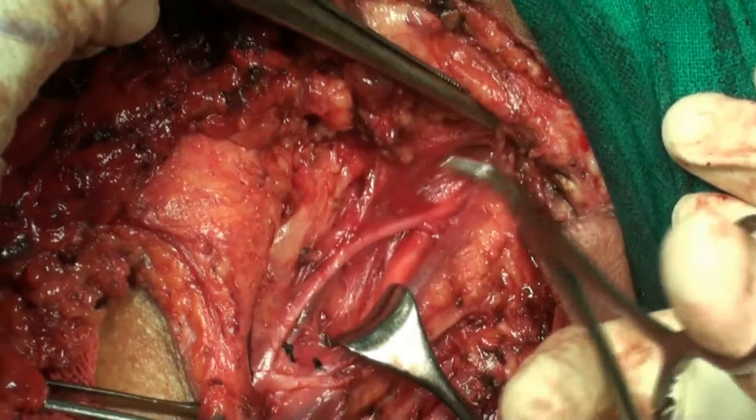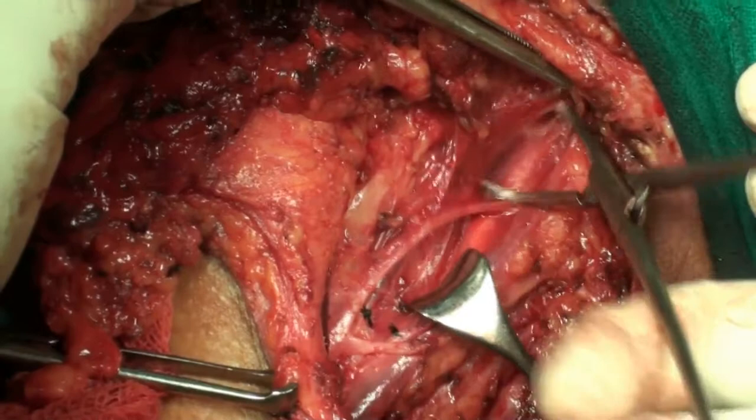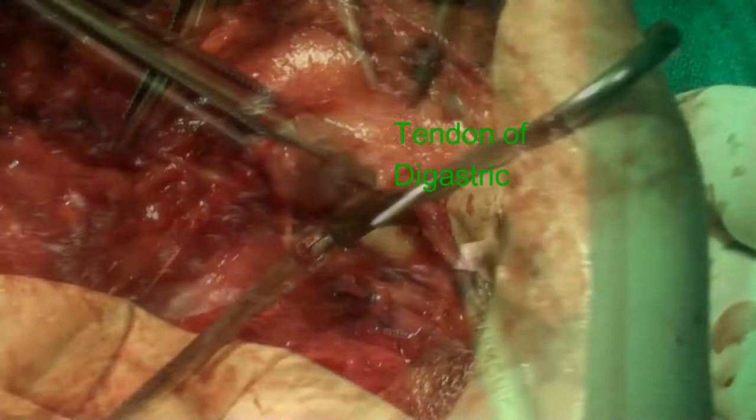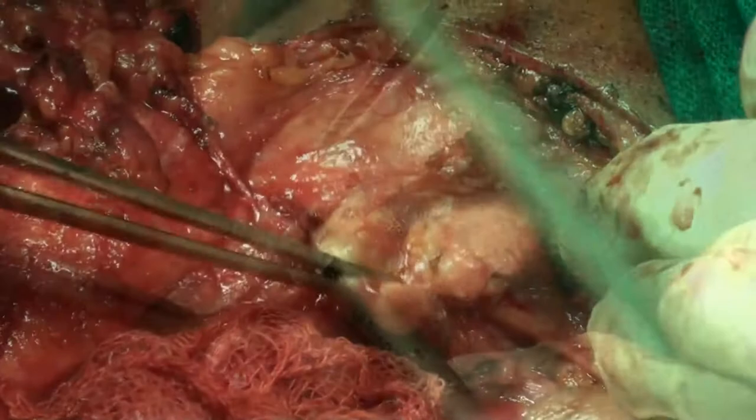There you go. Can you see that? Rahul? Yep. Here you have the glass. Is that the digastric? Yes, sir. That's my lighthouse here. I'll go over it. You will see many surgeries in one.